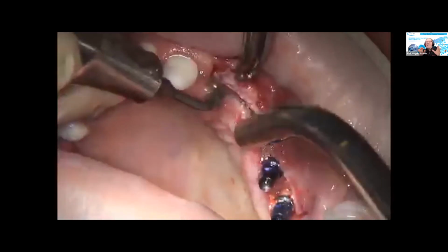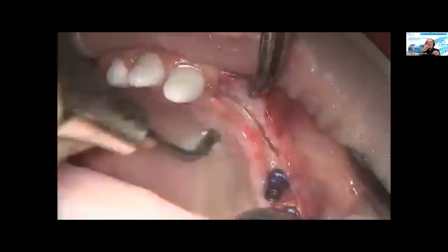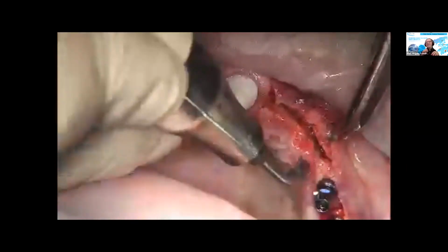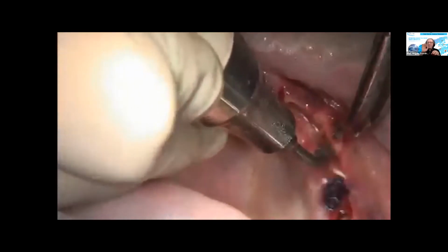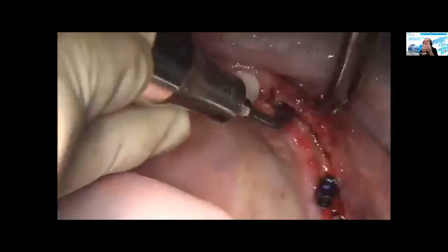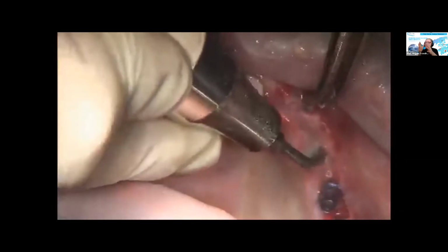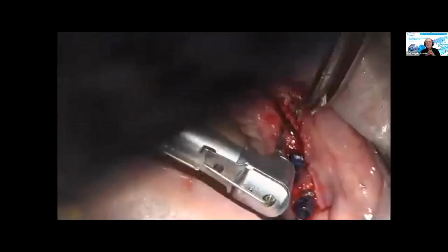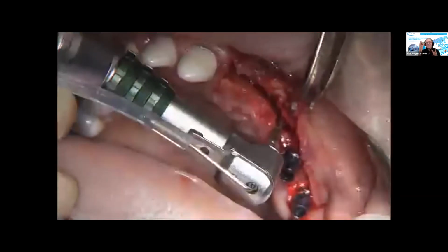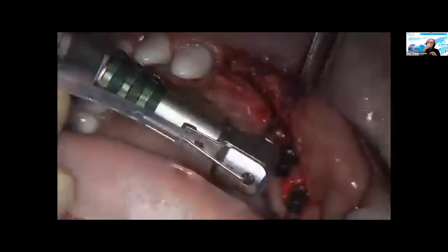But if you're already highly trained after some 40, 50 piezotome crest split, flapless, then of course you might opt to put in a chisel, because then you have the experience, you have the feeling, how does the bone react if I do it manually? Then maybe you will spare this step because it's also a short step. It takes you maybe for this size of the crest split 1 minute per tip, which adds up to 3, let's say 5 minutes. And with the chisel, you can slightly squeeze it open.